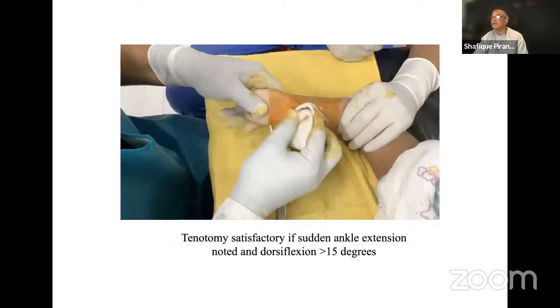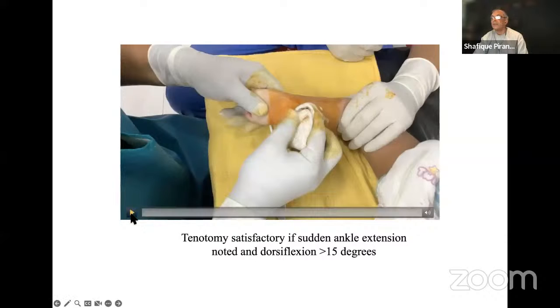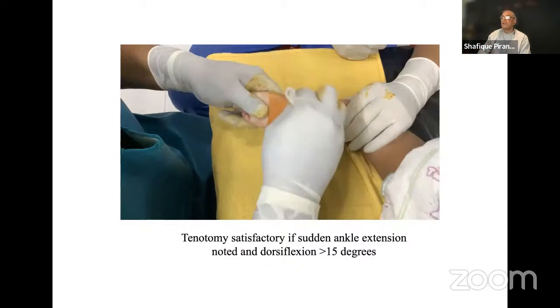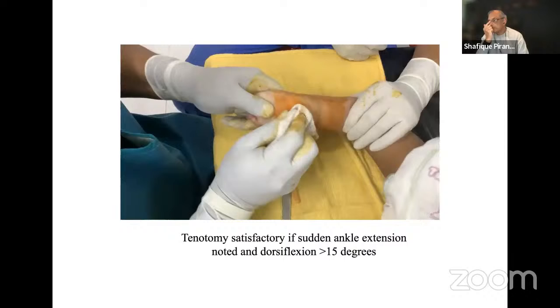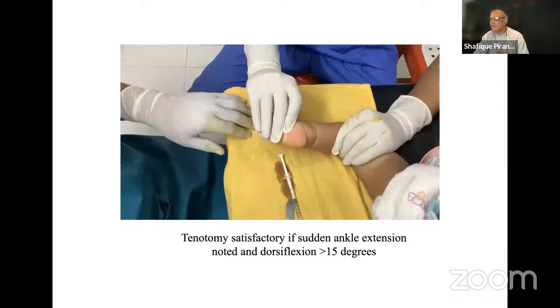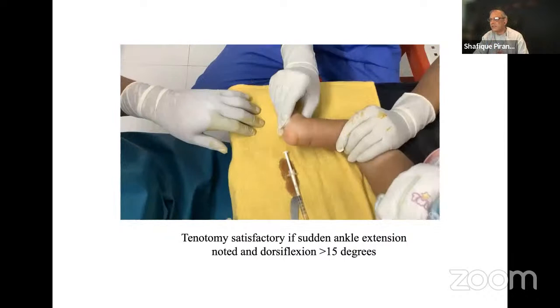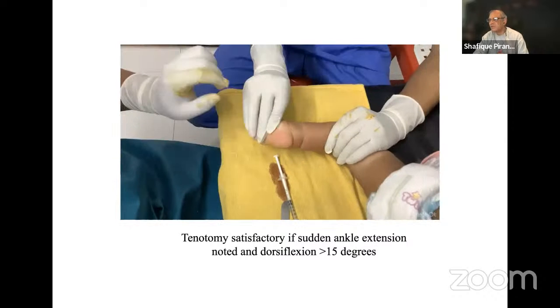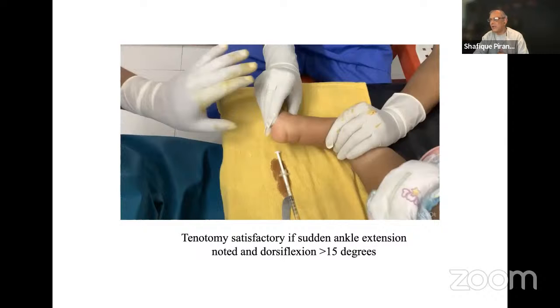And here's a little video to show it. And so this is the prep solution. And the surgeon holding, and the assistant holding the foot and showing that dorsiflexion is limited. You can see the posterior crease sign there.